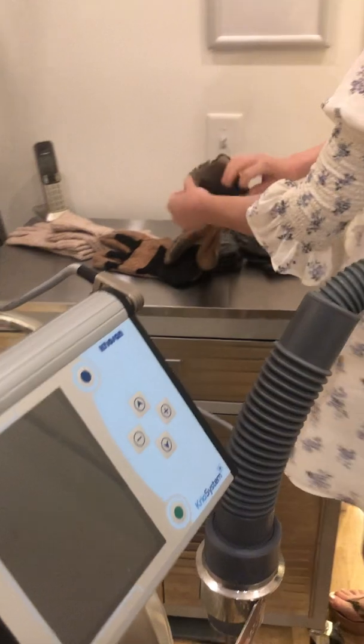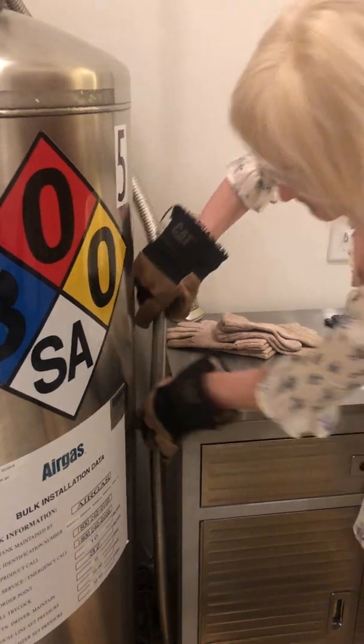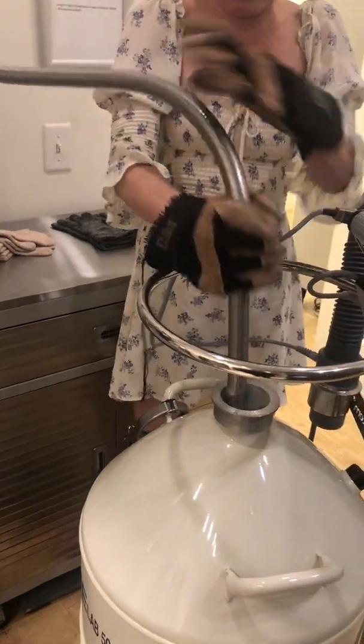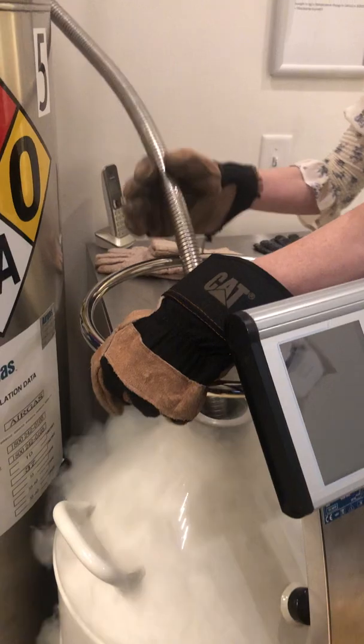The next part, I am going to wear my gloves. So I take my liquid nitrogen fill hose, which in my case is permanently attached to one of our dewars, and I stick it in probably just about as far as I can.